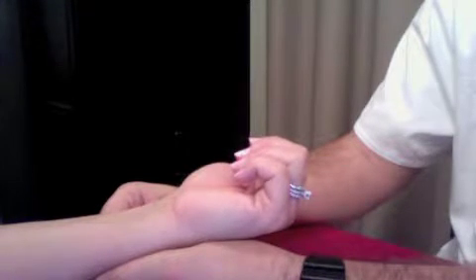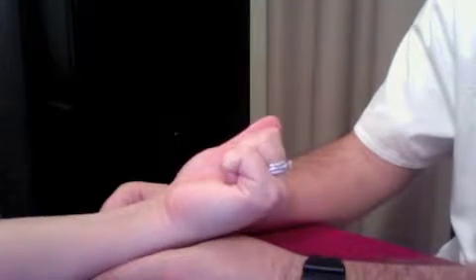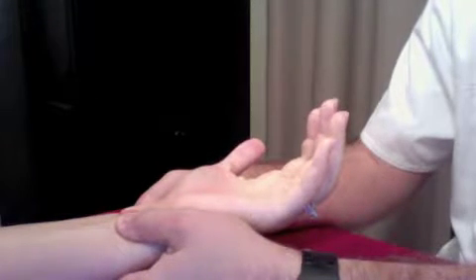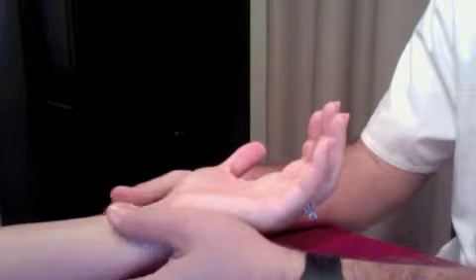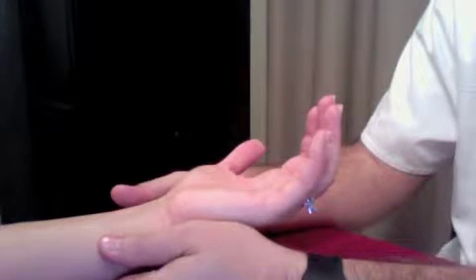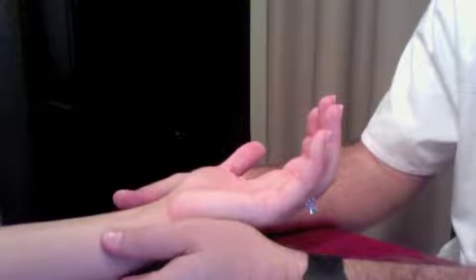To perform the Allen test, the patient will first clench their fist. The physician will then apply pressure to the radial and ulnar arteries. The patient will relax their hand, and the physician will look for blanched fingers. The physician will then release pressure and look for the color to return back into the fingertips. If the fingertips flush back with color within 5 to 15 seconds, it is a positive test and they can go ahead with the procedure.